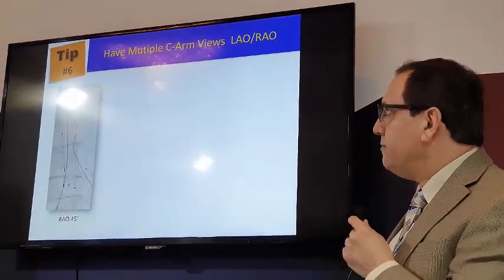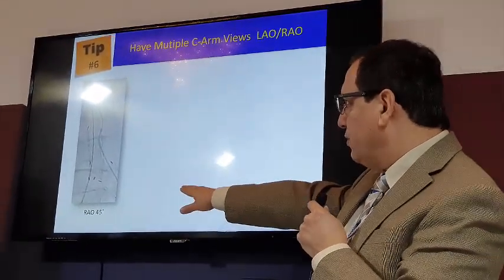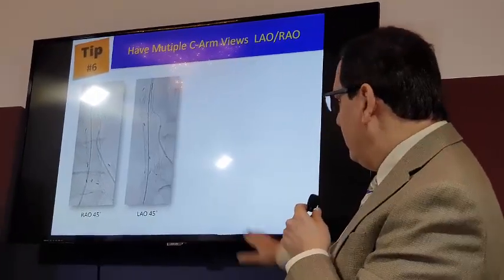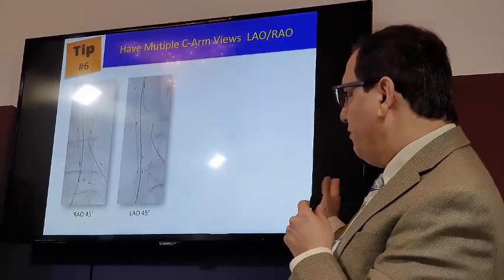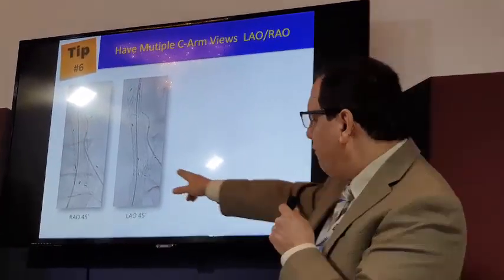Tip number 6, try to get multiple views. Like if you do this view here, RAO 45, it looks like you are in the right spot. But then our recommendation is to go LAO 45. So on RAO 45, go 45 LAO, and you see how far you are.